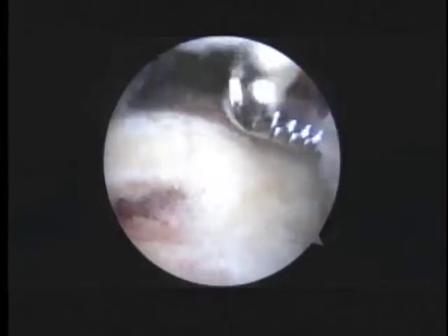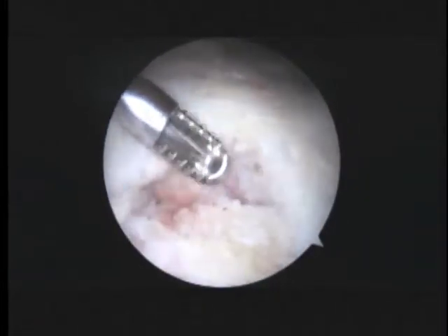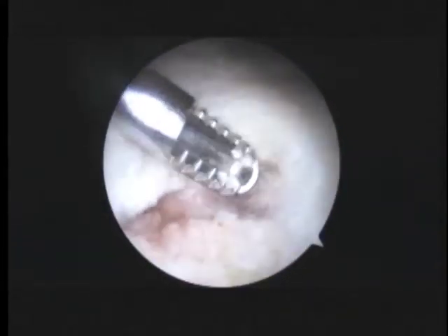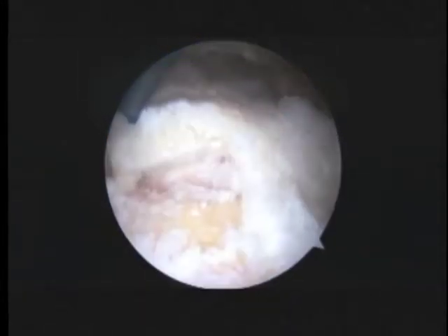Okay, and now we're going to put the shaver in the front in just a minute here. Okay, pause. Okay, so we've opened up the rotator cuff where it was torn. We can see it's getting attached. It's reattaching back there, so I'm not going to go any farther back posterior. We'll get this ready to go and show you some more in just a minute. Pause, please. I need the book.